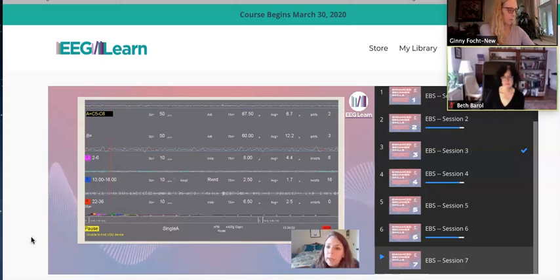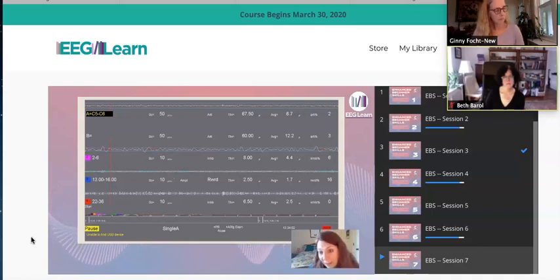Because if the average amplitude is 1.7, and we set that hurdle at 2.5 microvolts, that means they're only above threshold 16% of the time. A 65% threshold on your reward band is a moderate challenge level. So we have raised the height of that high jump, so that instead of that activity being outside the threshold 65% of the time, it's only outside the threshold 16% of the time. So that's a pretty tough challenge level.